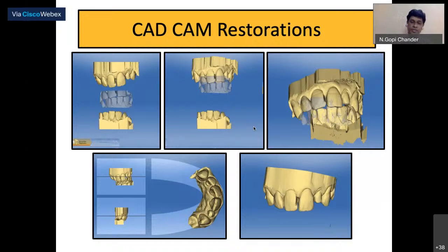And it helps in terms of designing the restoration. So whatever wax patterns you make, everything is done in terms of the designing. And instead of fabricating it, we just have the computer mill the restorations or print the restorations. So whatever time and energy you spent fabricating your restorations in your labs has been greatly reduced in terms of the workload involved.